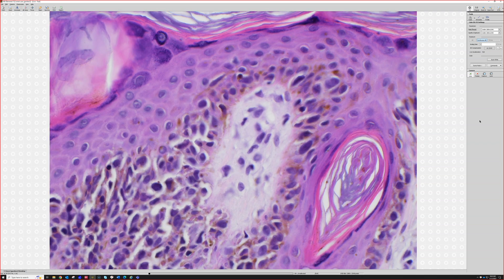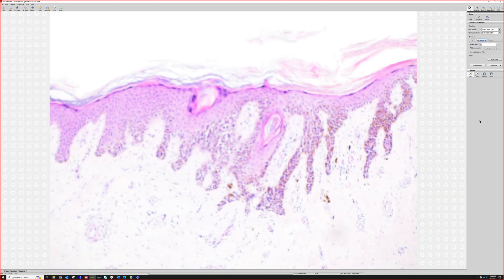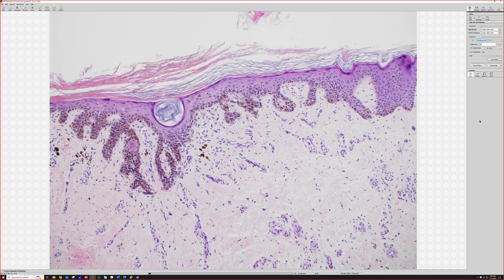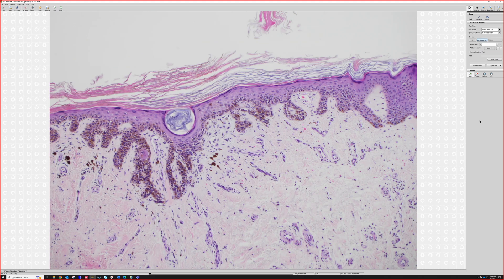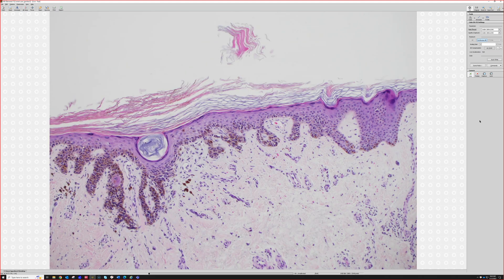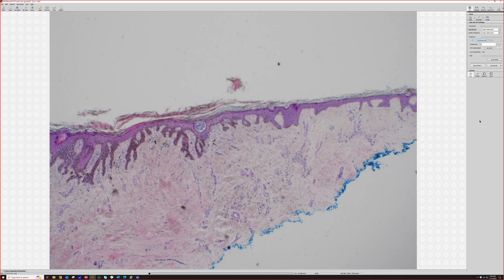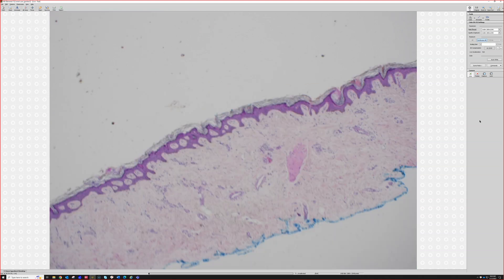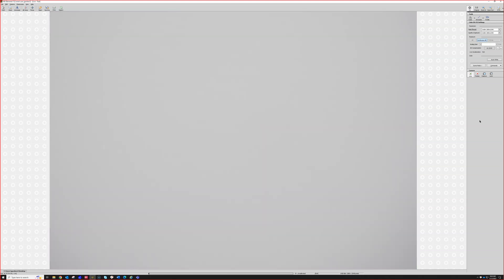So this is acral lentiginous melanoma in situ, and in this case it had involvement of the nail. But here it's extending onto the adjacent skin — I don't know if this is the lateral nail fold exactly; I don't recall all the details of this case. So this was an acral melanoma.